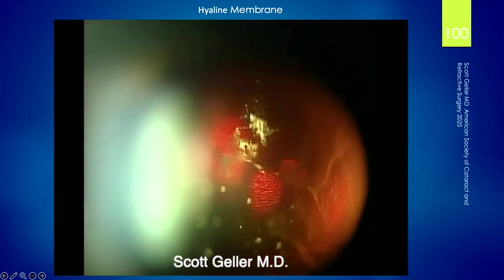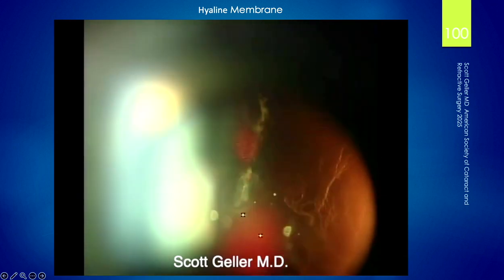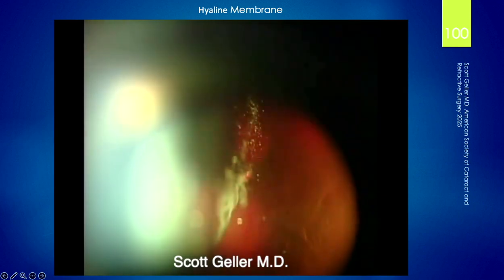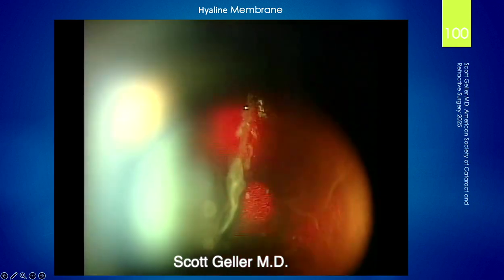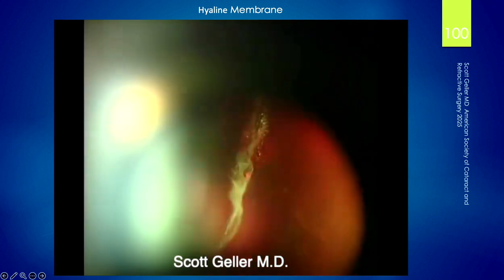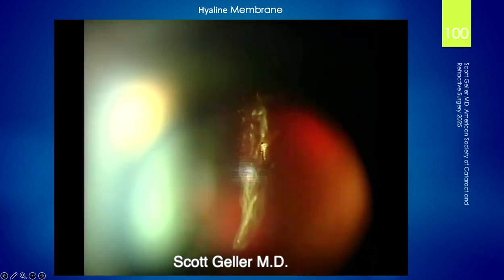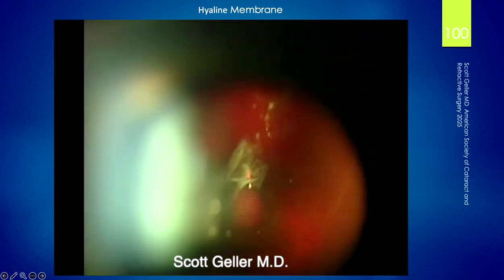You can see how the sides have retracted. This is a speeded up video. That might be the third or fourth session. And this cannot be done in one session. And there I'm going after a little bit of the hyaline opacity there. Break that up a little bit, just like you would a normal Weiss ring thing, and get a happy patient from this. Fascinating, isn't it?